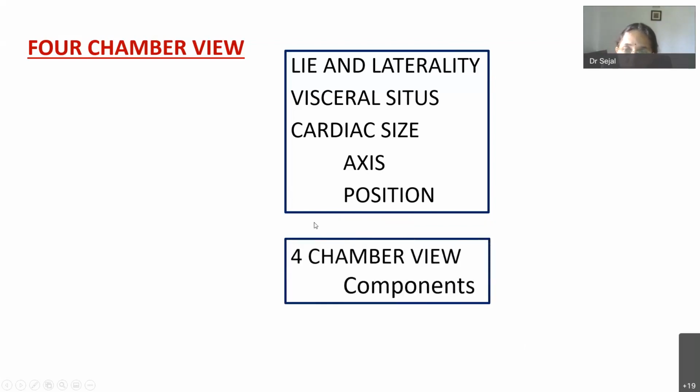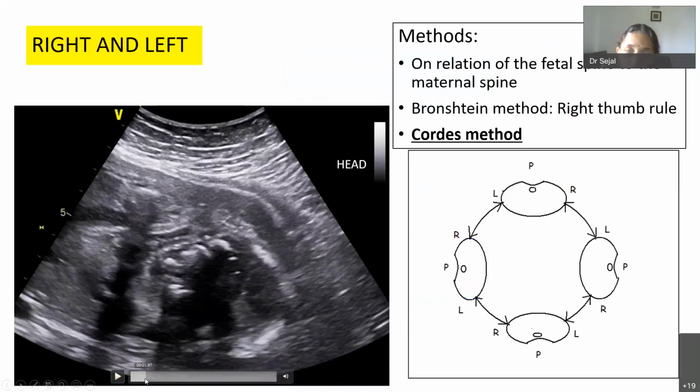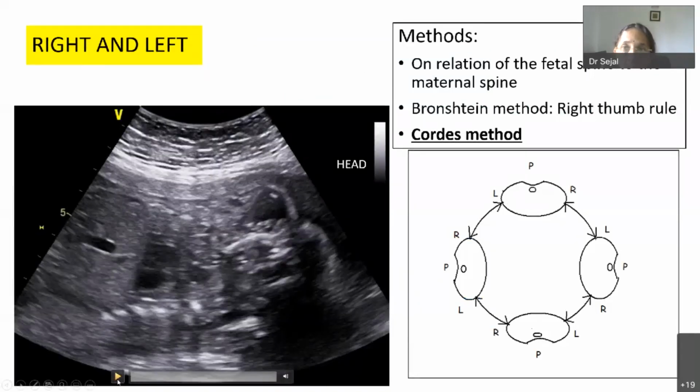And then you will see the individual components in the 4-chamber. The 4-chamber view is not a complete understanding on its own. However, to start with, it gives a lot of basic clarity on important things related to the heart. We will also see what all we can see in a 4-chamber view and what all we cannot see.